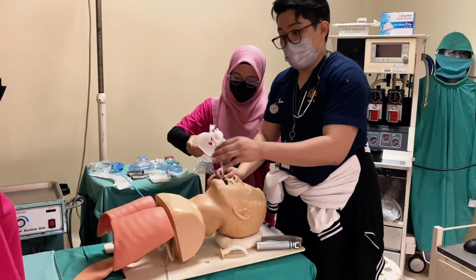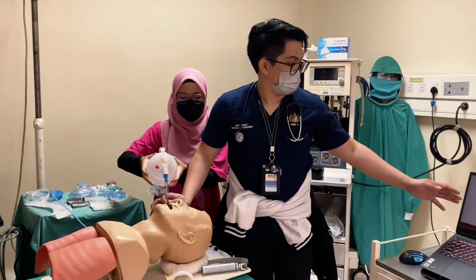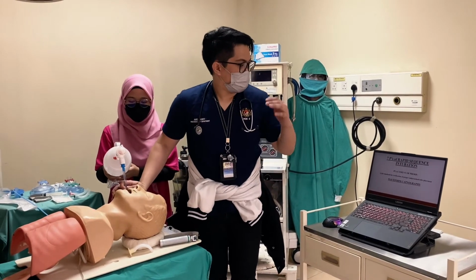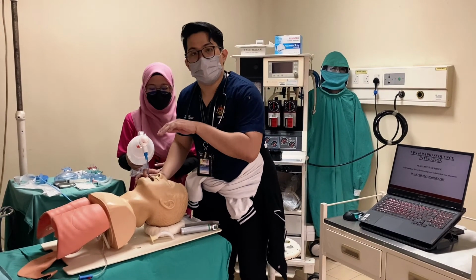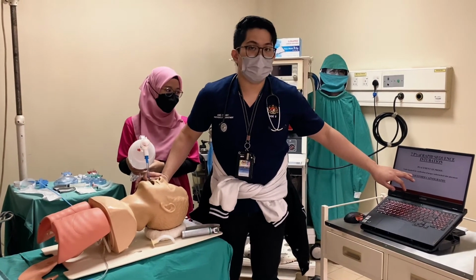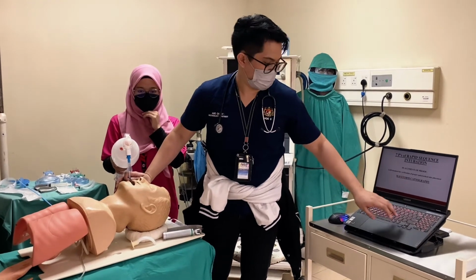Unfortunately, we will not be able to see the lung directly because this is just a mannequin. That is why we will go to the sixth phase, that is the placement of proof. In the new standard, especially nowadays, the gold standard for verification of proper endotracheal tube placement, which means whether the tube went to the lung properly or went to the stomach, is by using this medical equipment that we use nowadays, the capnograph, where we see the presence of waveform capnography.